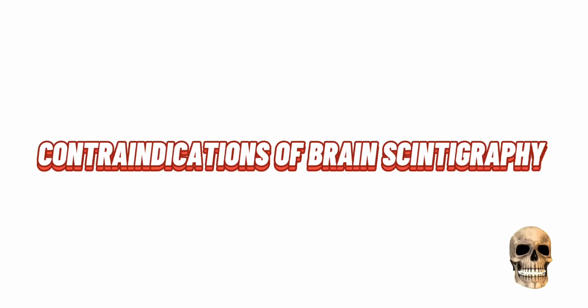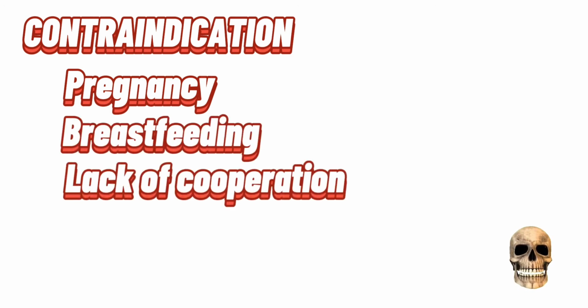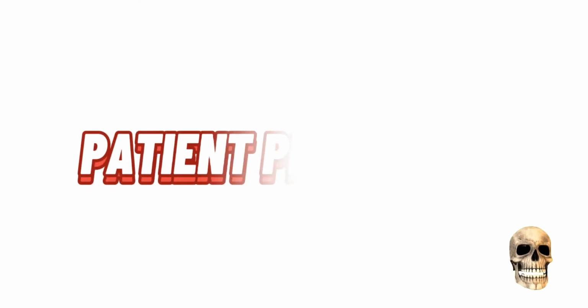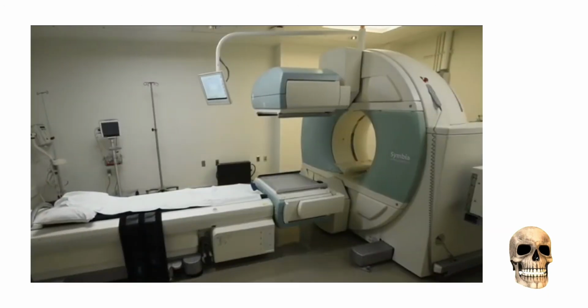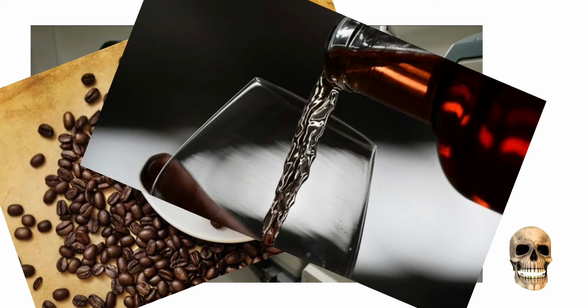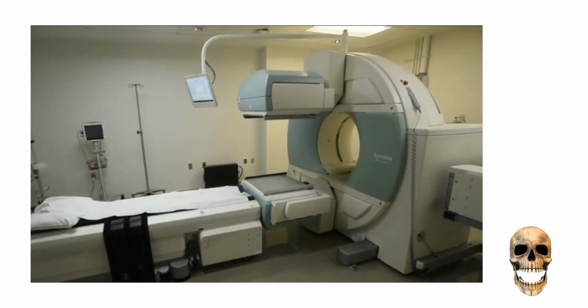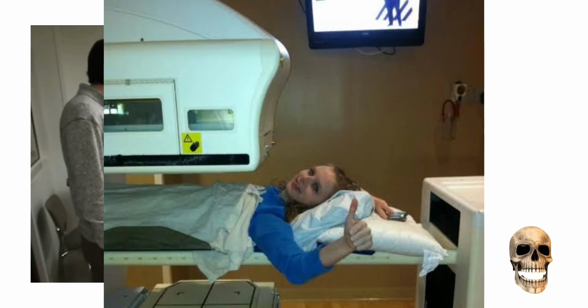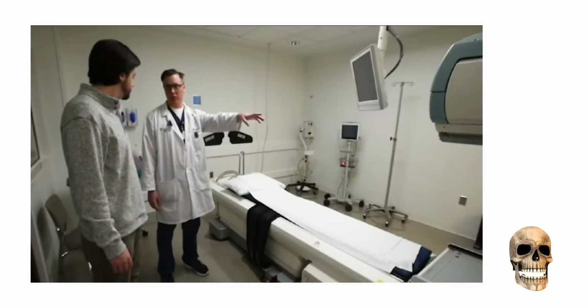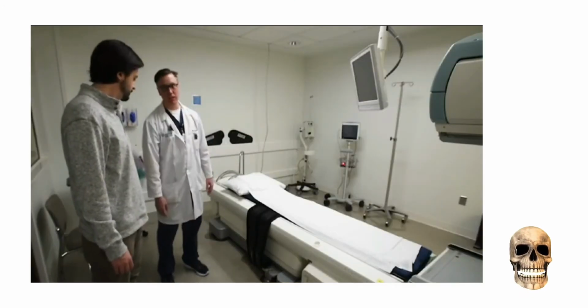The contraindications of brain scintigraphy are pregnancy, breastfeeding, and lack of cooperation. Patient preparation. Patients should be instructed, if possible, to avoid caffeine, alcohol, and other drugs known to affect cerebral flow. The most important aspect of patient preparation is to evaluate the patient for his or her ability to cooperate. Achieve a consistent environment at the time of injection intake.